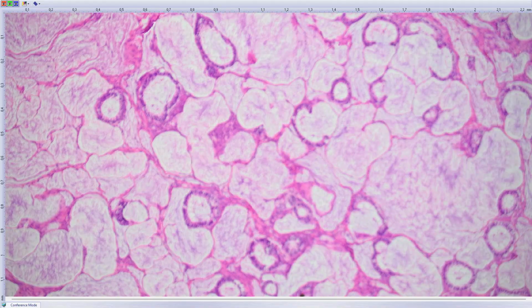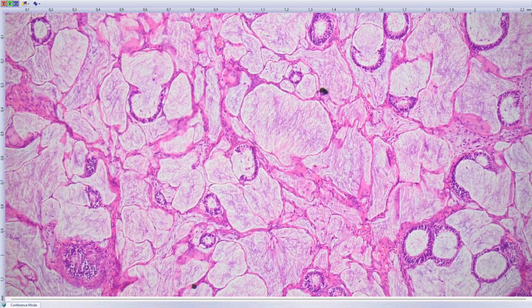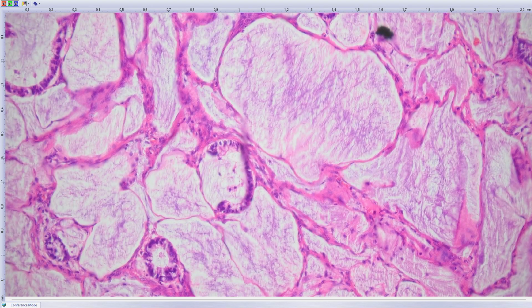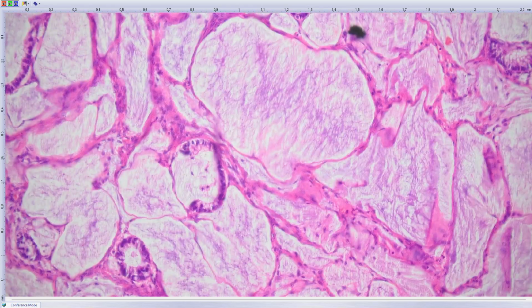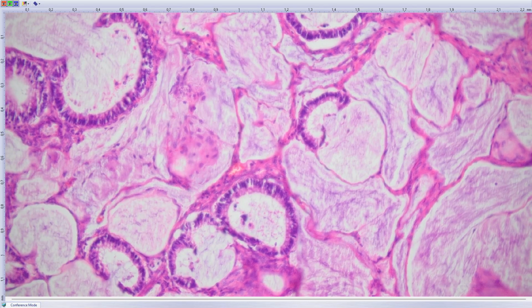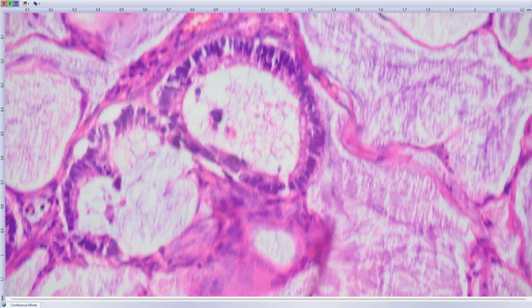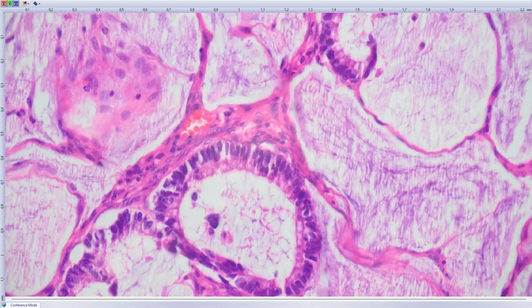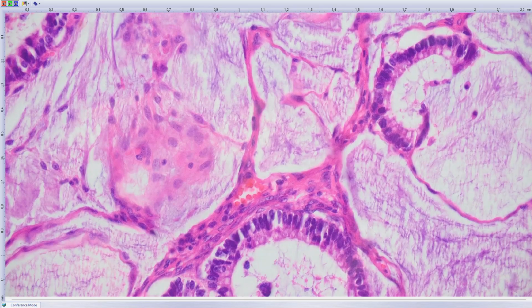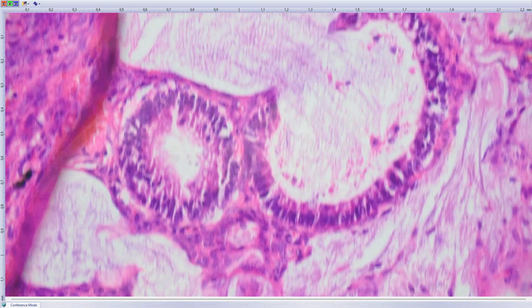And the last case I show you is a tumor of the ovary, which came to us in consultation with a diagnosis of ovarian adenocarcinoma. What is typical of these lesions is this hyperchromatic slough of cells inside the glands. You can find this in nearly 100% of the cases. Do you see these debris inside the glands?